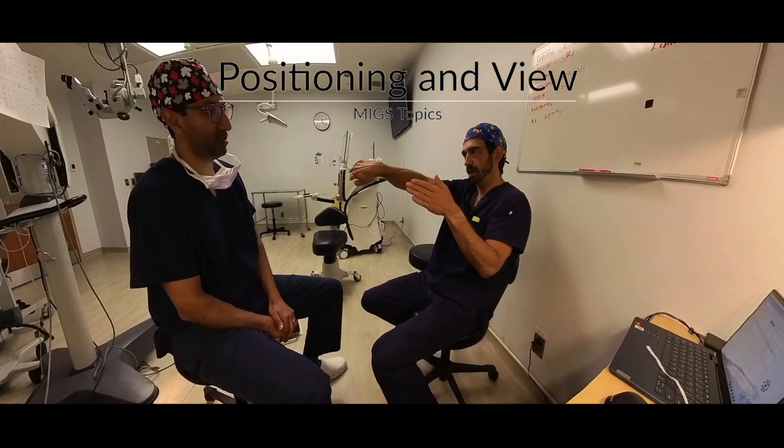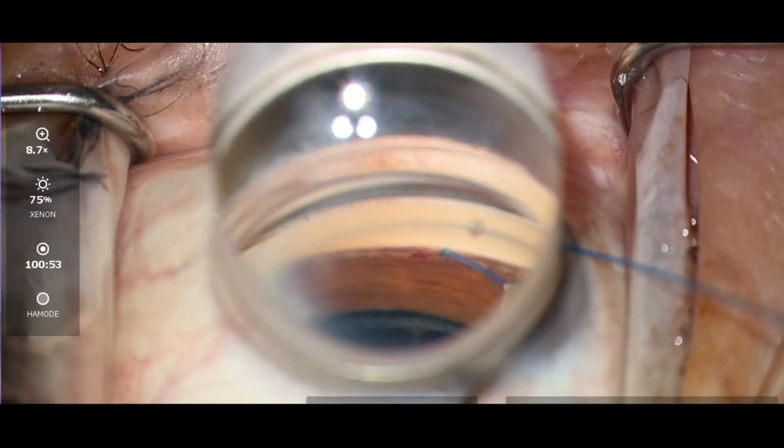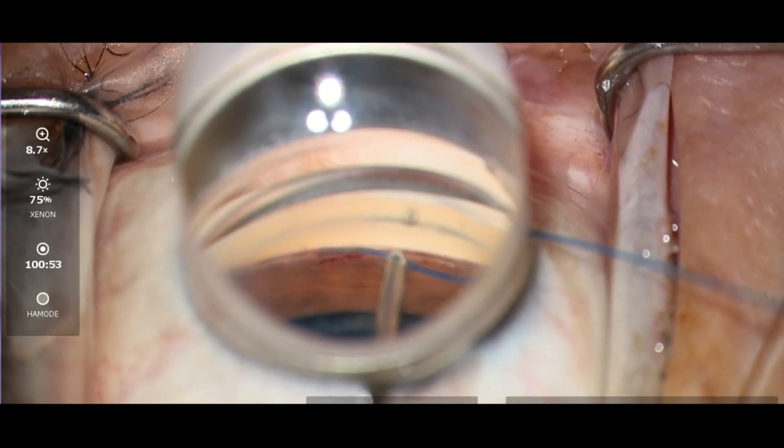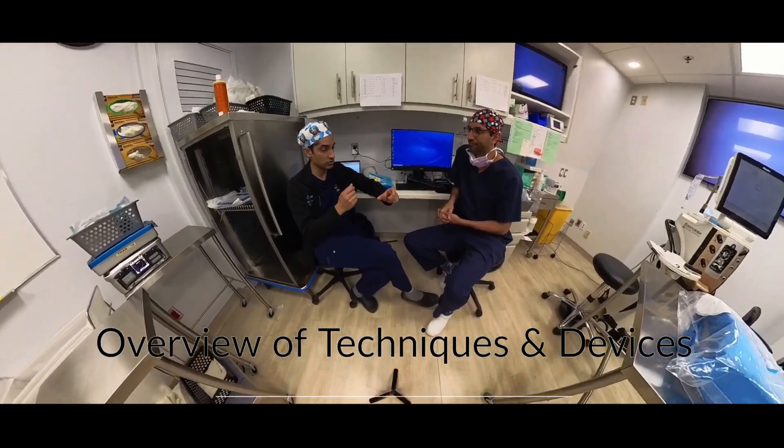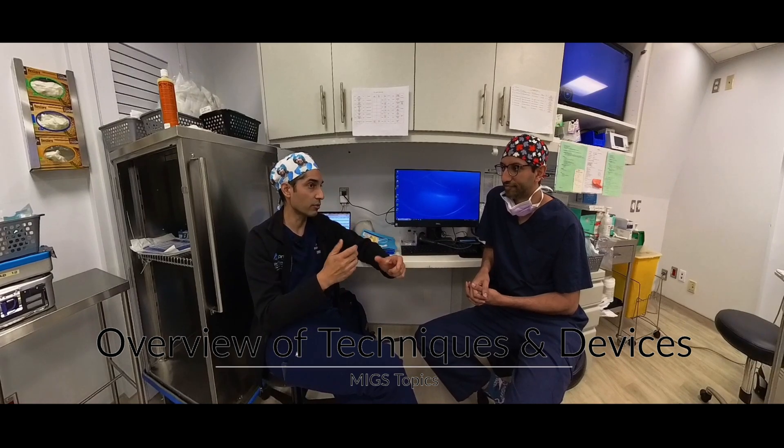Don't part the Red Sea — push the blood this way, and you've got to keep on doing viscoelastic. The actual device is a little bit bulkier and sturdier, and you can actually use that to push the eye a little further away.